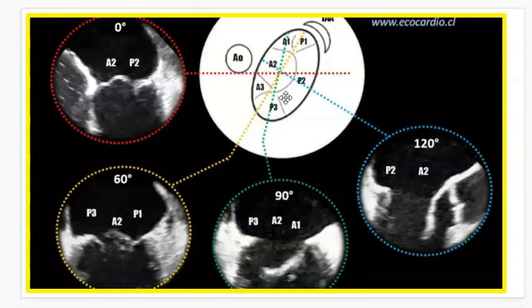So TEE is used a lot for deep examination of the mitral valve in certain hospitals. At Mercy, we don't do a whole lot of deeply examining the mitral valve, although the techs want to, but the doctors aren't extremely interested in that, simply because they'll just transfer patients to a valve center to get this done. They'll identify where the leak is.